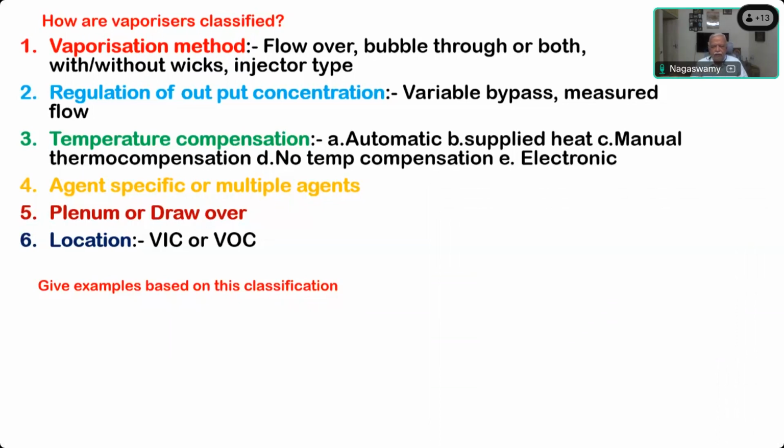From the vaporizer, gases are coming partly to the breathing system, which is a circuit system or the spontaneous system. Okay. But if you are going to use the vaporizer within the circuit system, it is called inside the circuit. If it is outside the circuit system, it is called vaporizer outside the circuit. So anything on the back bar is always outside. Please remember that. Don't get confused.